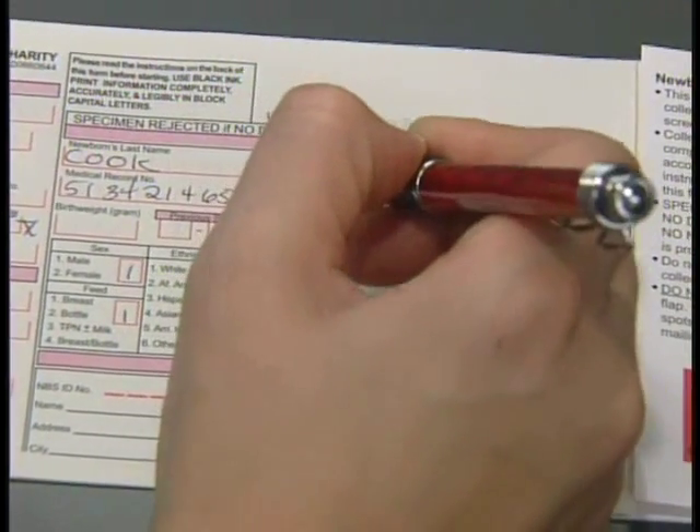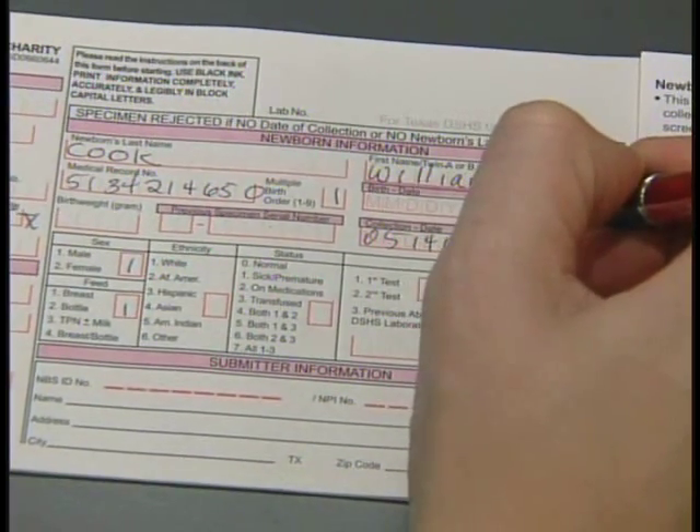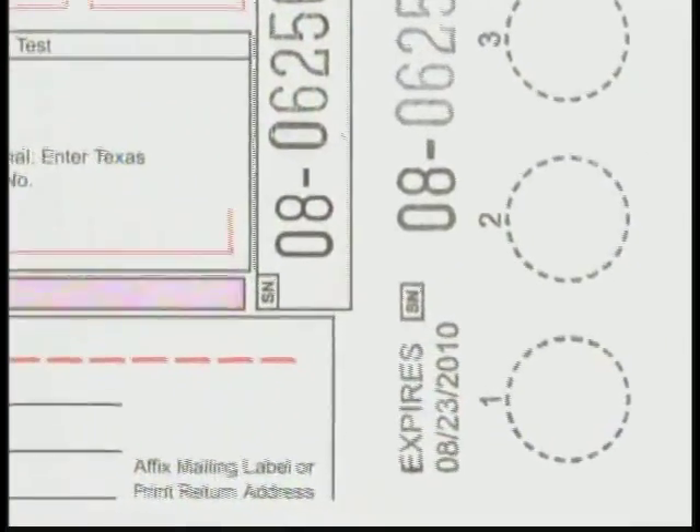The specimen collection form must be completed with all information filled in before the sample is collected. The form is made of a special filter paper with five circles for the blood sample. It is imperative to avoid contaminating the filter paper. Do not allow the circles to come in contact with spillage, and do not touch the circles before or after the blood is collected.